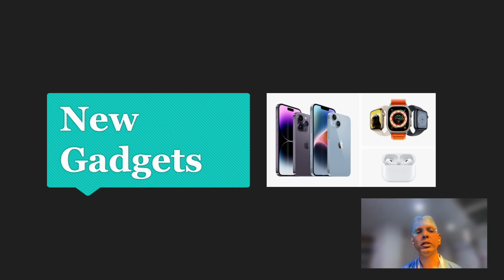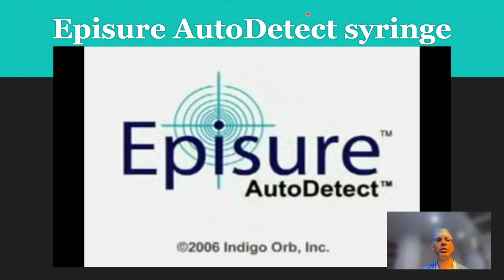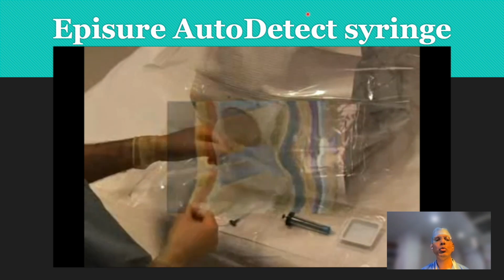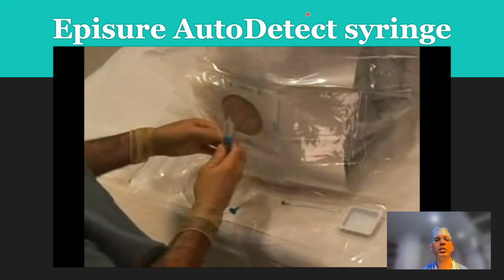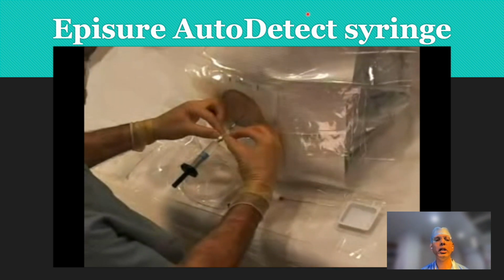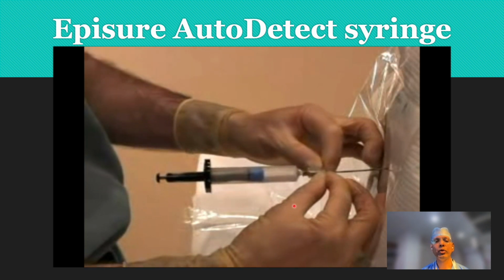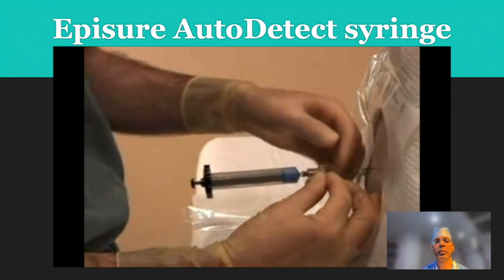We all love new gadgets, and technology is so advanced that we have a few gadgets for epidural space identification also. And what are those gadgets? Mechanical devices such as the EpiSure Auto Detect syringe. These syringes provide visual confirmation of loss of resistance. This syringe includes an internal compression spring that applies constant pressure on the plunger and automatically depresses when the needle enters the epidural space. Here one can use both the hands while visually you can confirm the loss of resistance of saline once the needle enters the epidural space.